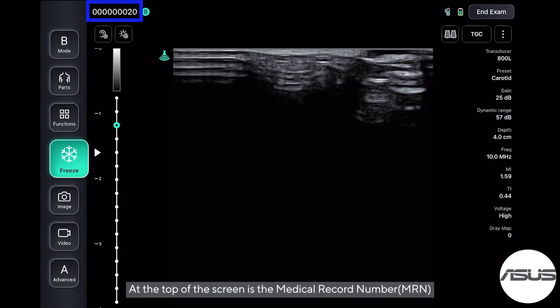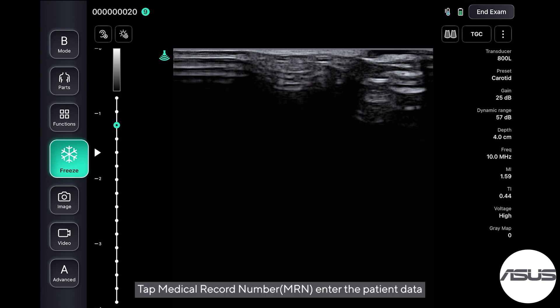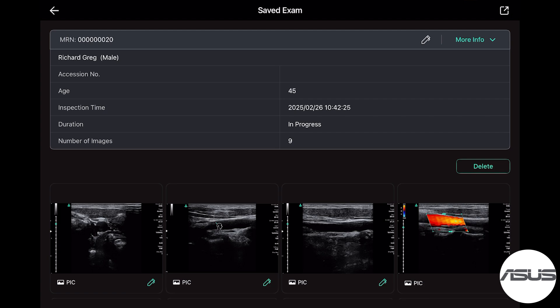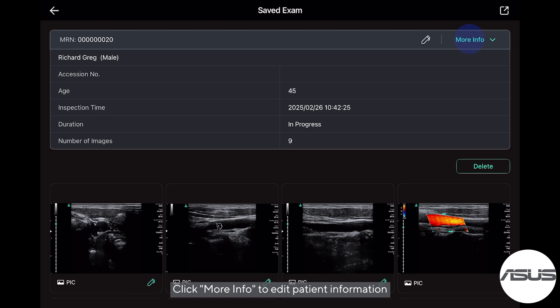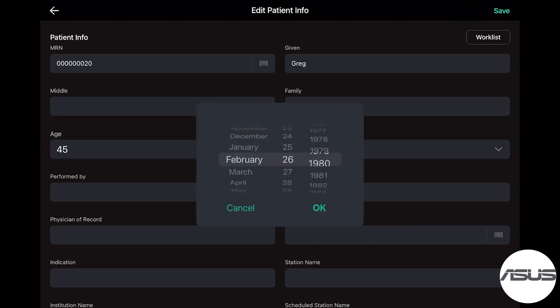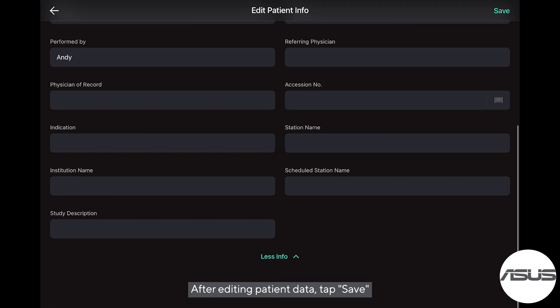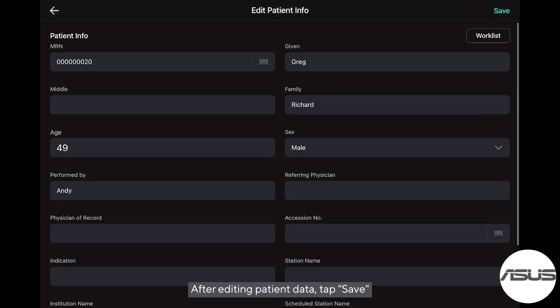Click on the Medical Record Number (MRN) at the top of the screen. Next to it is the number of stored images and videos. Tap the MRN to enter the patient data and click More Info to edit patient information. After editing patient data, tap Save.